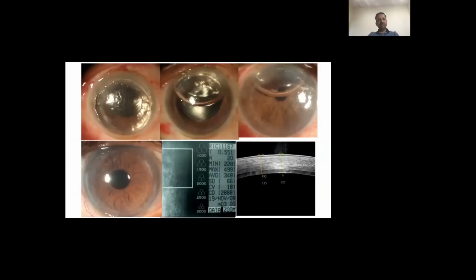Post-operatively, you do a complete air fill, but then you have to watch out for any evidence of pupillary block. To avoid that, you can consider doing an inferior peripheral iridectomy, either preoperatively or intraoperatively, using either a vitrector or a surgical PI. Then you don't have to worry about the complete air fill and the risk of pupillary block.